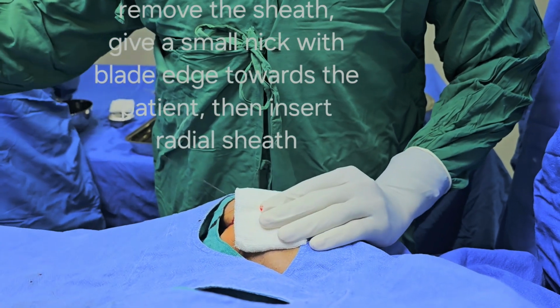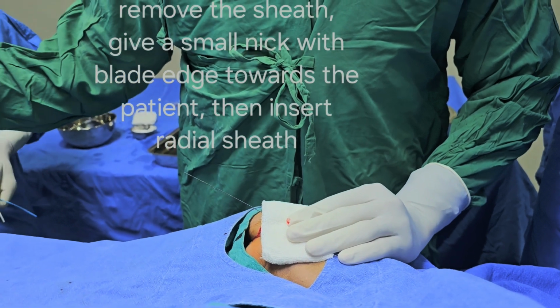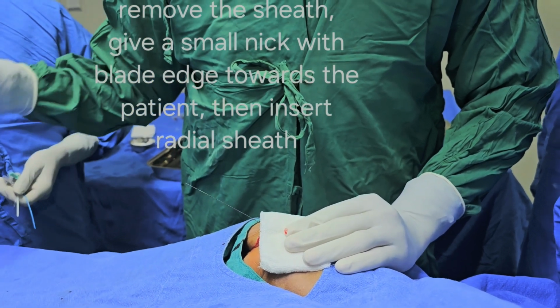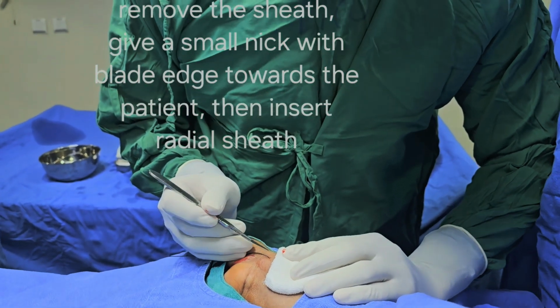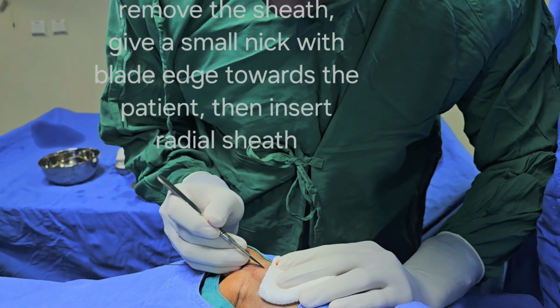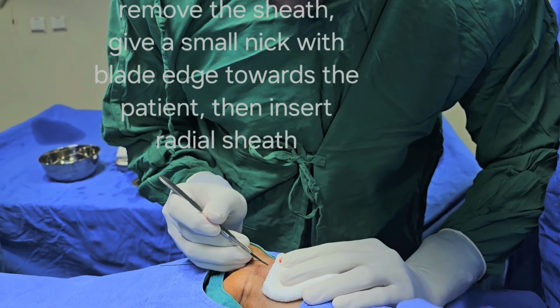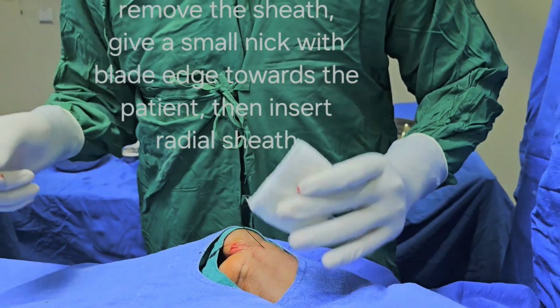Give a small nick with the blade over the skin. The blade edge should be towards the patient, towards the medial side. Give a small nick along the wire, then insert the radial sheath. Check for pressures, then aspirate and flush the radial sheath. Then you are good to go with the procedure.